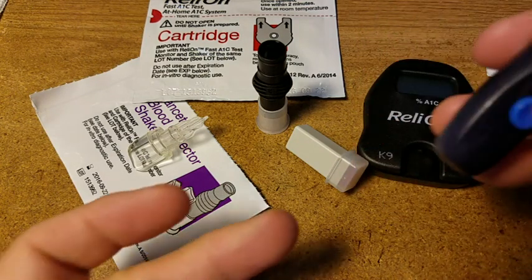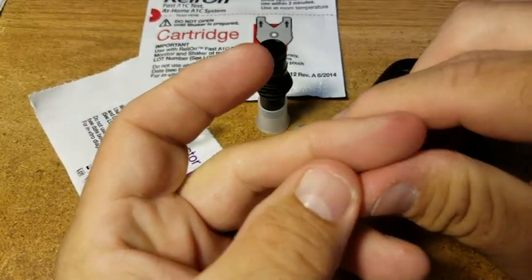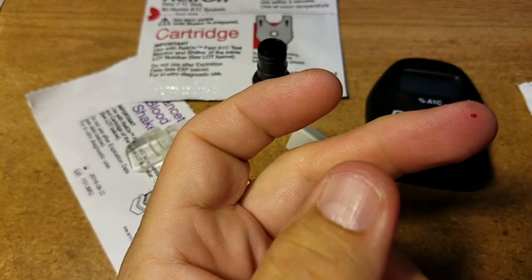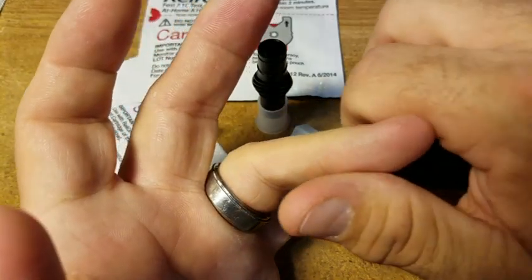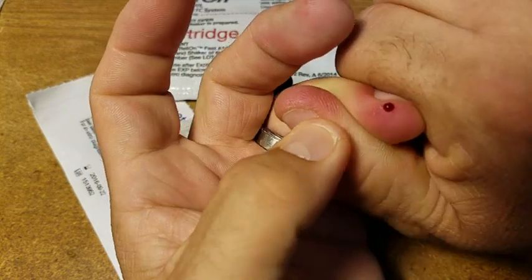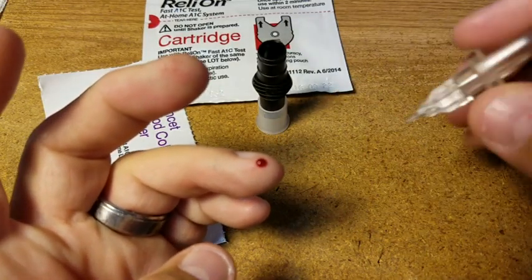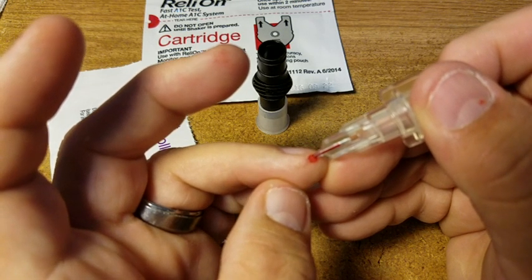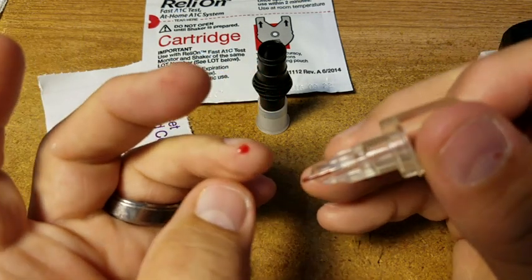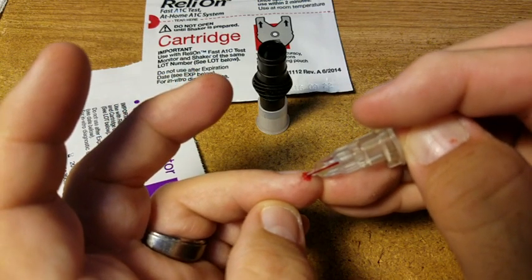I'm pushing the lancet in real hard because I want to get a good sample. I don't have a lot of feeling anymore. Let's do it again — try here. Okay, that's a good sample I guess. I'm going to take the sample collection tube and touch it to let the blood go up through capillary action. I need some more blood — there we go, some more blood up in there. Okay, now it's completely filled.